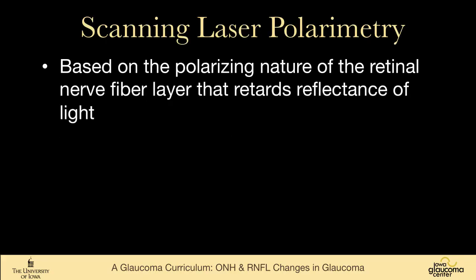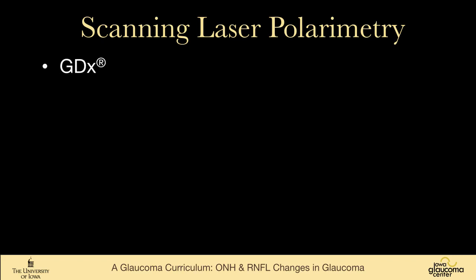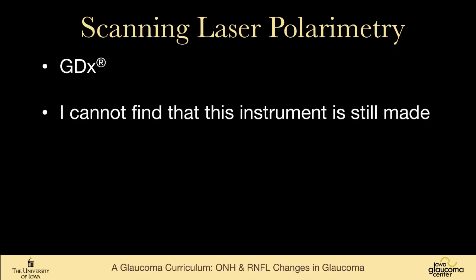Scanning laser polarimetry is based on the polarizing nature of the retinal nerve fiber layer that retards reflectance of light. Unfortunately, the cornea also has polarizing effects, so the signal needed to be corrected for the cornea, and this was the basis of a device called the GDX. And I can't really find that this is available anymore. I certainly haven't seen a GDX scan in many years. So it's probably important that you know that it existed and know that it's based on scanning laser polarimetry, and that the cornea has an effect on scanning laser polarimetry.